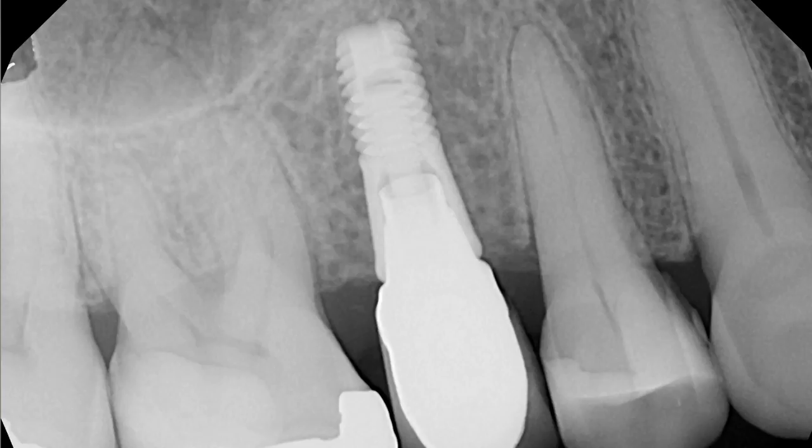You can see from this case that the conical connection of this UCLA abutment to this implant is fitting adequately. You can also see the platform switching that takes place with this sort of design. And then lastly, you check your occlusion.